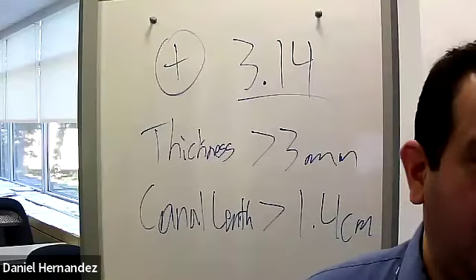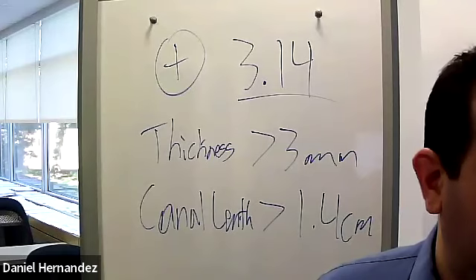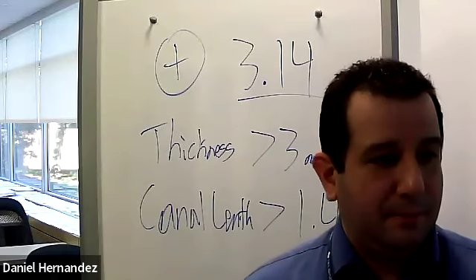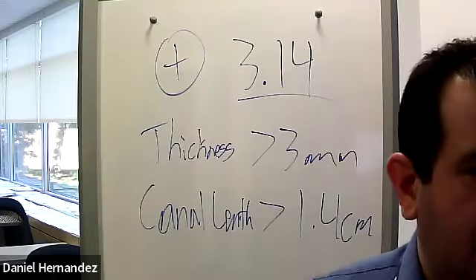Then if the stomach's overly distended, sometimes this could displace it posteriorly, making it very hard to delineate. This is one that was likely positive now.